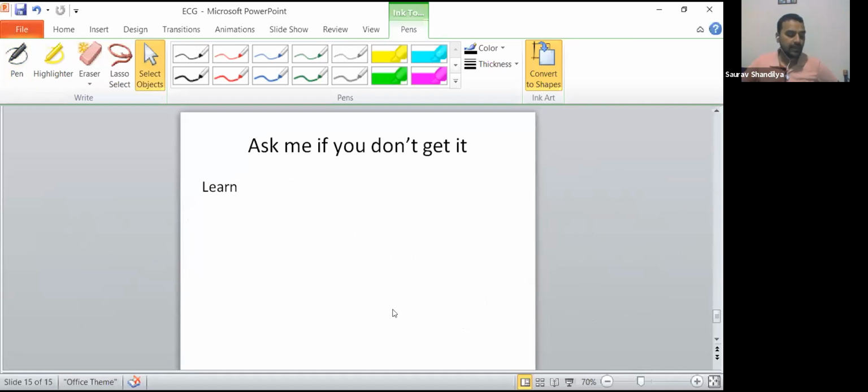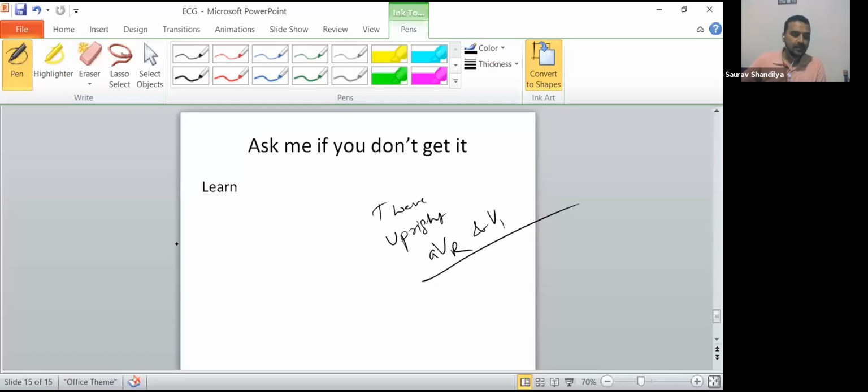Now the last is the T wave. What do you see in the T wave? Either you will see the normal upright T wave. The T wave, as I told you, is always upright except in aVR and V1. Now hyperkalemia, you would have heard, more potassium. In that case, what happens? Peaked T wave. Why? Because of repolarization with more potassium. Not only the T wave will confirm it, even the PR interval will be longer and other things. I don't want to get into that.